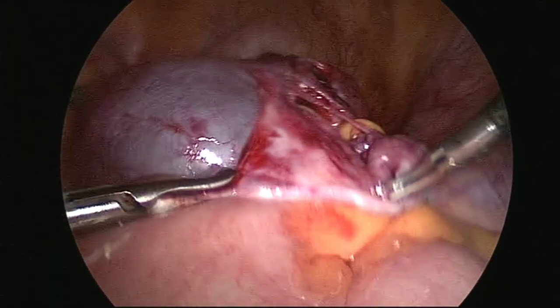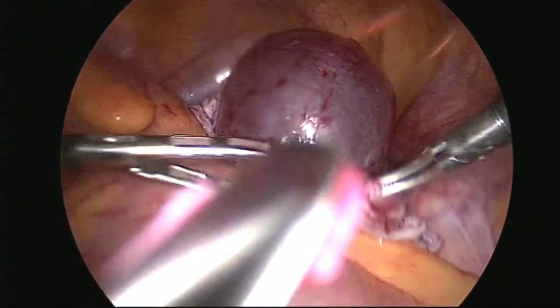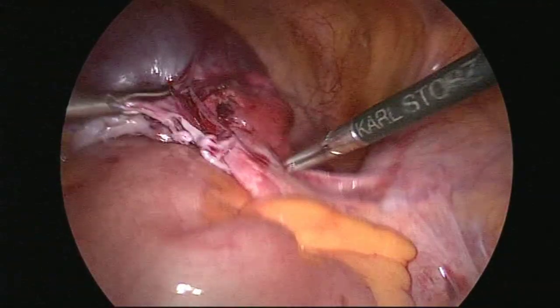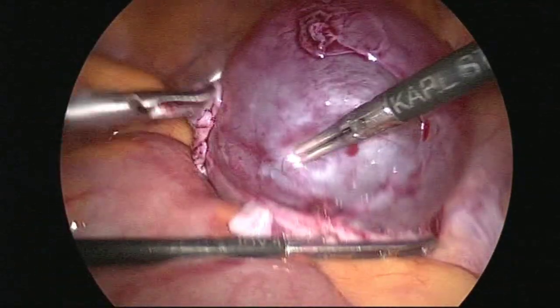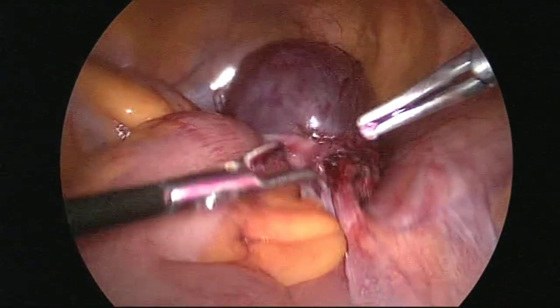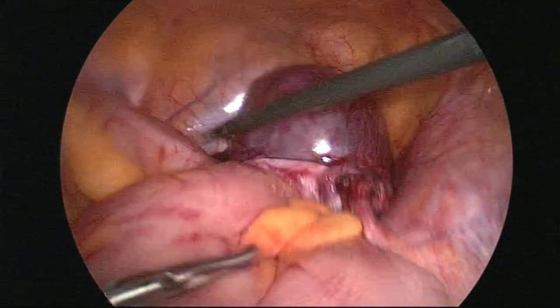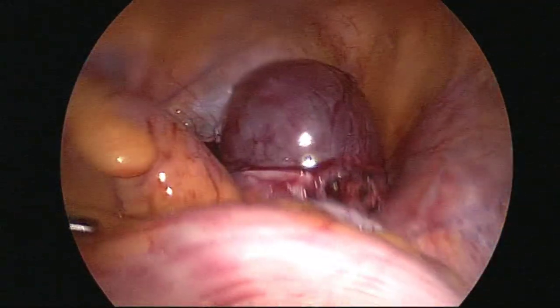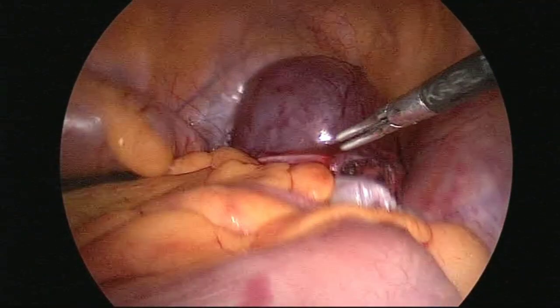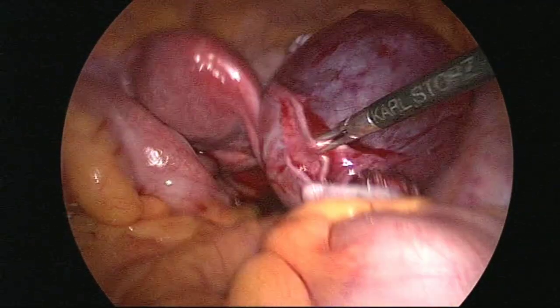Most of the time cysts get ruptured at the base, so somehow we have to manage that it should not rupture. Till now there is very little bleeding. Intestine is giving me trouble.